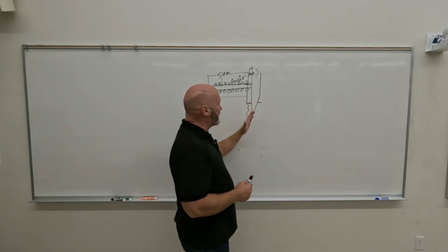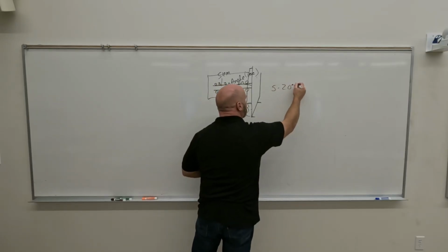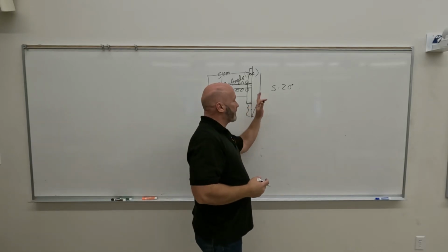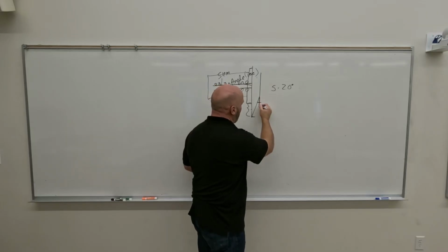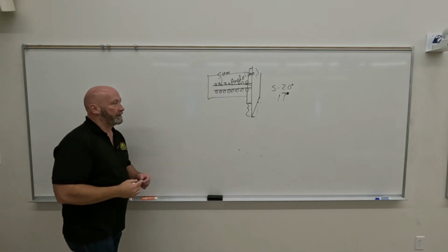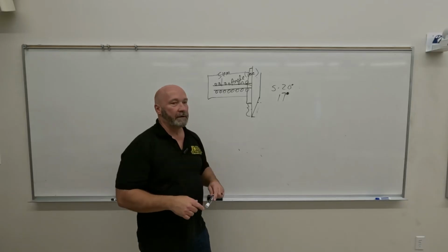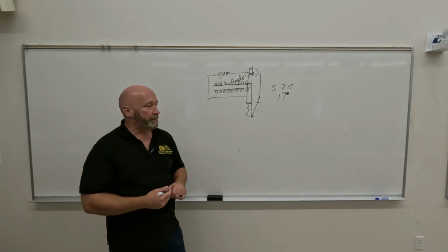All right, so your anode is going to come with an angulation, and that angulation is going to be anywhere from 5 to 20 degrees. So the smaller the number, the more vertical it is. So a 5-degree angulation would be almost completely vertical. Okay. So most of them are going to come in around 17 degrees, but it could be 5 to 20. What that's going to control again is angulation, but it's also going to control your sharpness of recorded detail. So you've actually got two things that go into your sharpness of recorded detail.